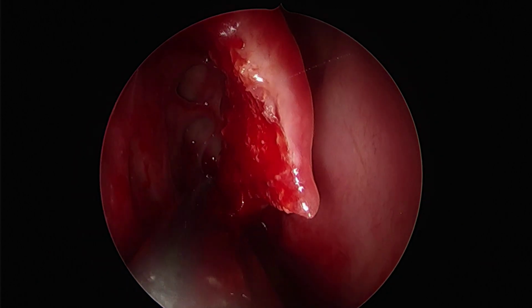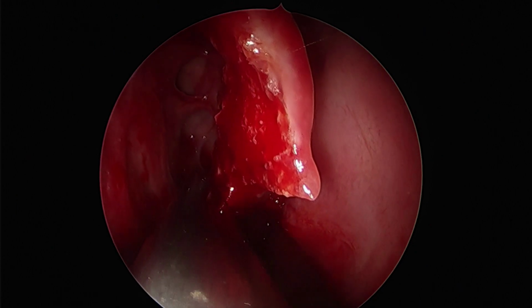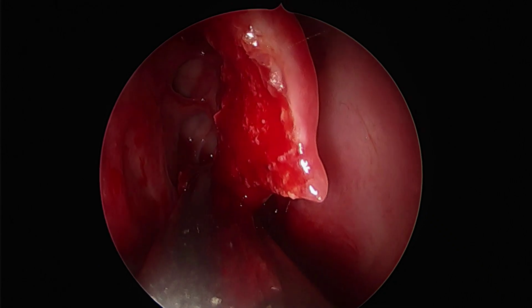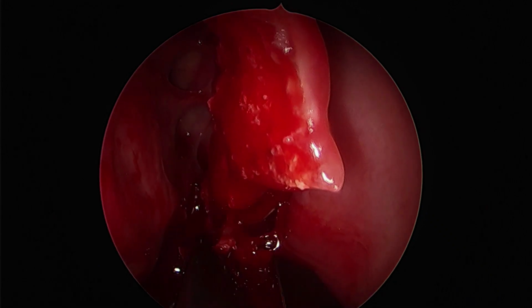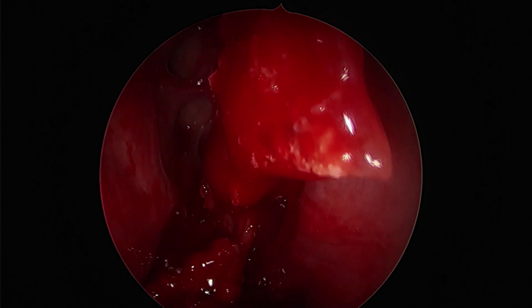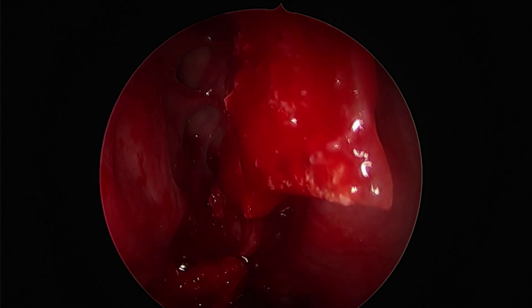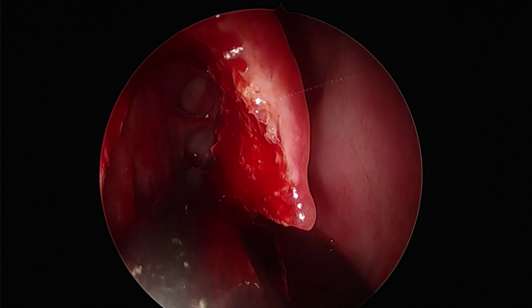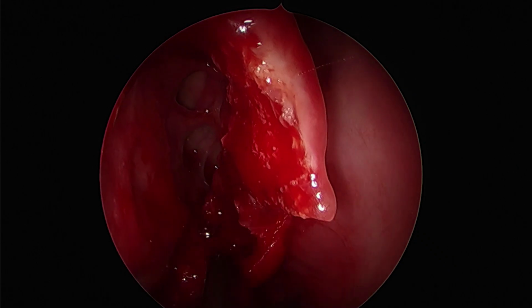Any straight scissors or a straight sharp through cut is adequate for this step. One must not use too much Blakesley or torse the middle turbinate, because that ensures that it does become floppy. So sharp instrumentation avoids any undue force, rotational force on the middle turbinate.